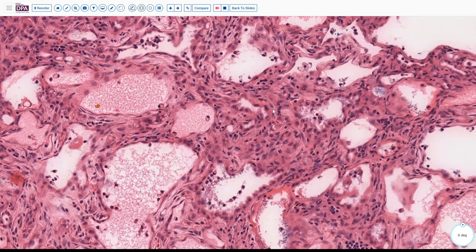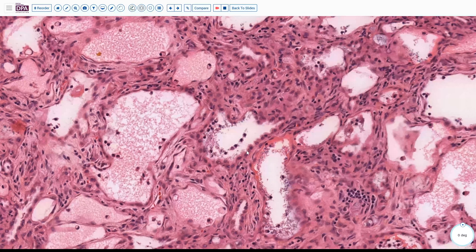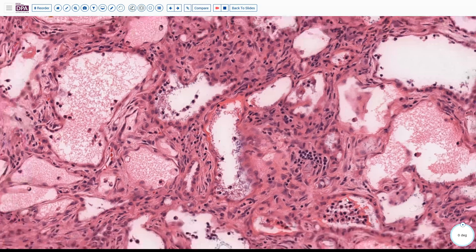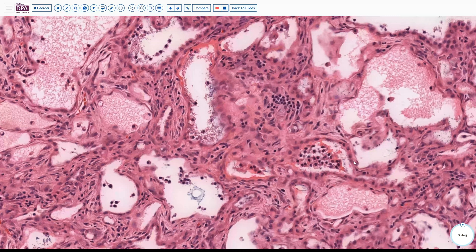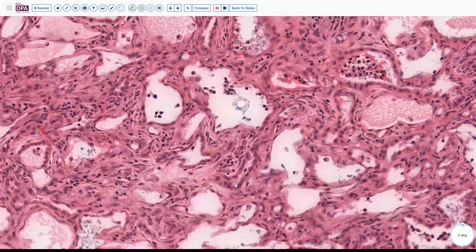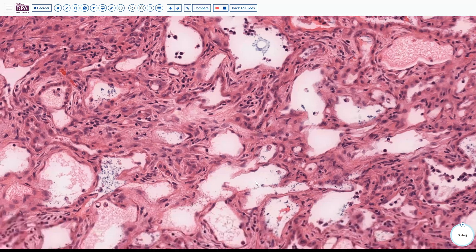Many of these spaces, if not all, are lined by somewhat cuboidal, slightly globoid cells, sometimes with a slightly clear cytoplasm, relatively benign, bland appearing cytology. The lumen contains a mixture of some inflammatory cells, eosinophilic fluid, macrophages, and so forth — no necrotic debris.